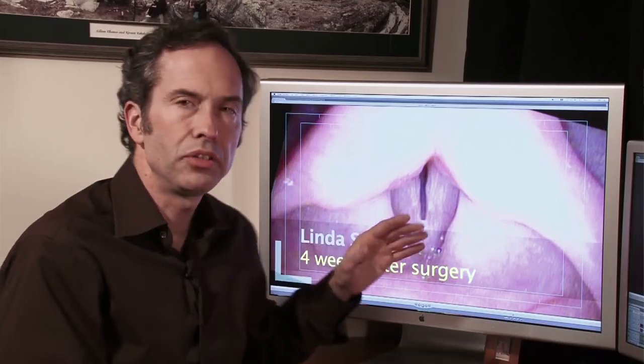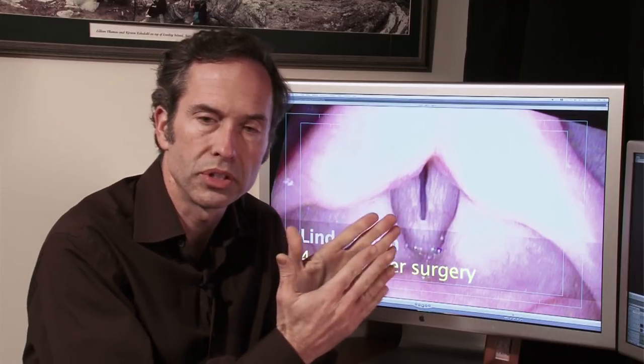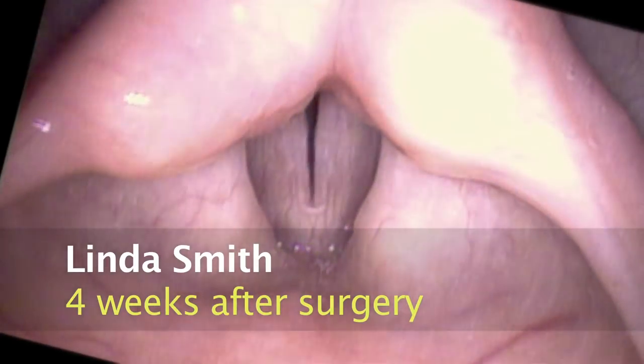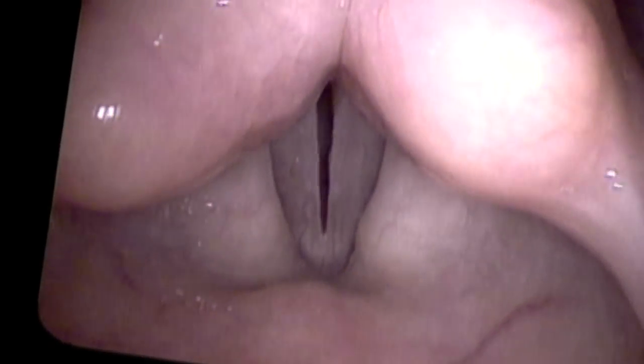Our goal is to have flexible vocal cords that come completely together. We're going to look at her at several pitches. Specifically, the higher we go in pitch, the tighter we pull the vocal cords. If there's any stiffness from the surgery, we'll see it magnified at high pitch. She's very supple at low pitches and fairly supple as we get to the mid and higher pitches.